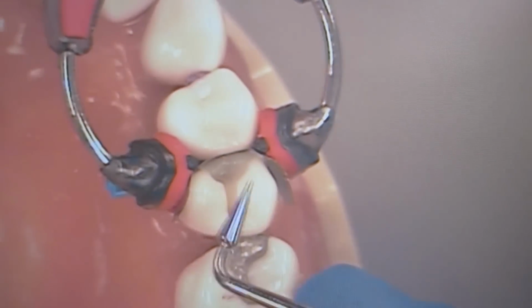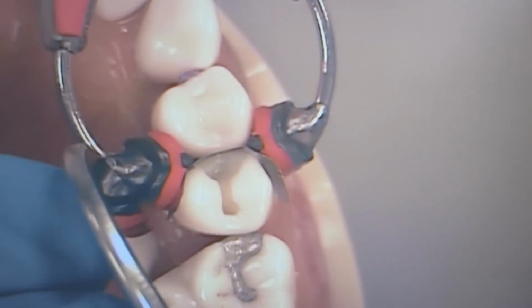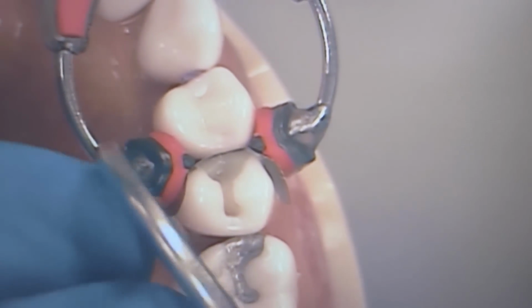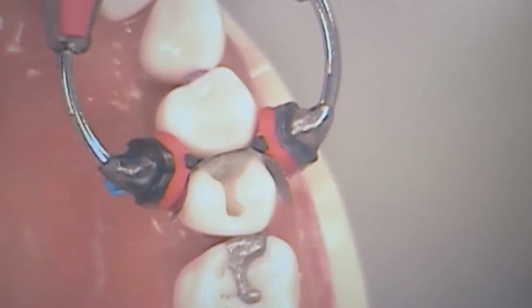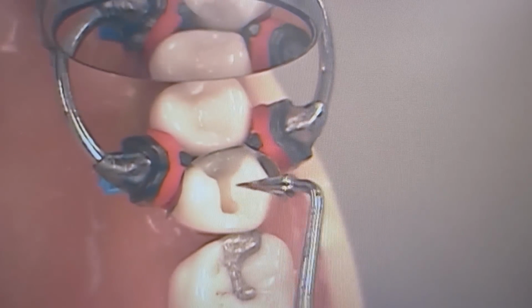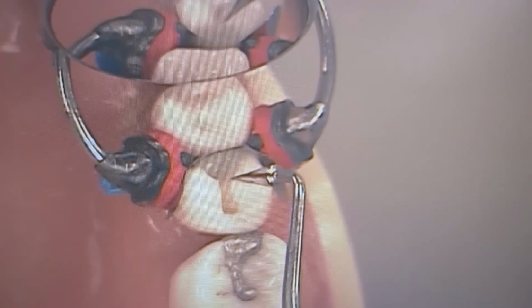Do you think you can show that with a mirror? That it's the angle you're holding. Oh, like the angle of the way you're holding the instrument? Yeah. Can you angle that? That's what we want right there. Yeah, is that better? Cool. Yeah, just like that. Angling it that way. Thank you.